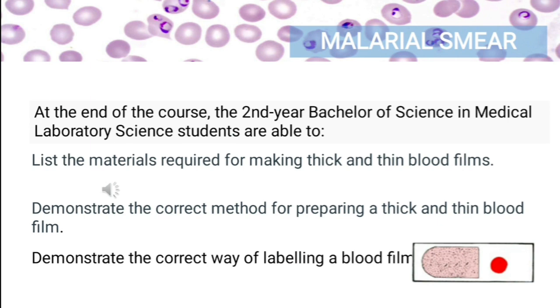The greatest number of parasites is present in the blood in between characteristic bouts of fever and chills resulting from the release of merozoites and toxic waste products from infected RBCs, which is known as paroxysms. Thus, this is the optimal time to collect peripheral blood samples to determine the presence of Plasmodium species parasites.